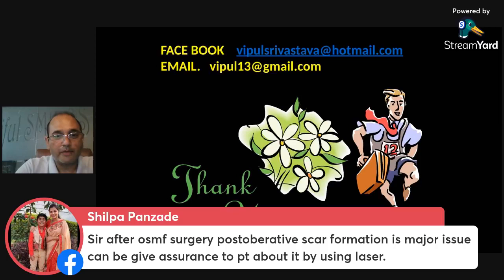Now, you need to understand that with the laser, we are doing a fibrotomy. Even with the conventional method, I'm not an expert of oral surgery, but I do have some renowned and very close friends who have guided me over the period of time. Whenever we are doing a surgery with the scalpel also, we never give just a thin line of fibrotomy. We used to do a blunt dissection, where we break the fiber and create a space between the surgical sites so that they don't get approximated together, right? So we give a blunt dissection.